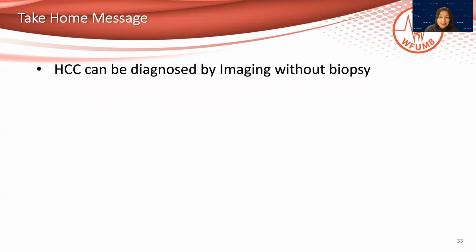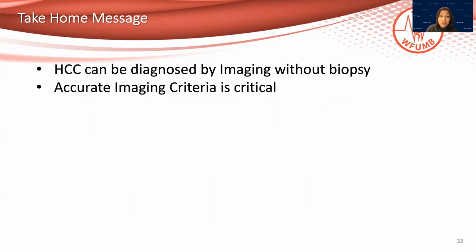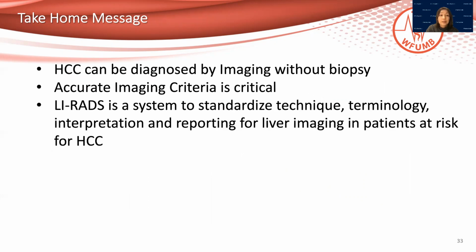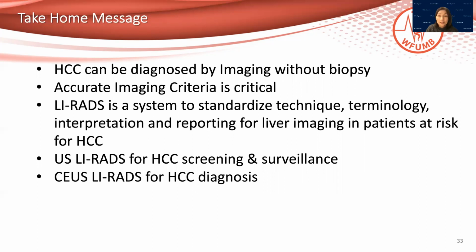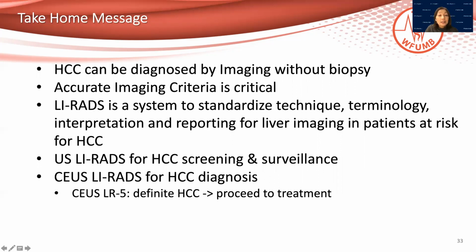To summarize, ladies and gentlemen, HCC can be diagnosed by imaging without biopsy. Therefore, accurate imaging criteria are critical. LI-RADS is a system to standardize technique, terminology, interpretation, and reporting for liver imaging in patients at risk for HCC. CEUS LI-RADS is developed for HCC diagnosis with CEUS.